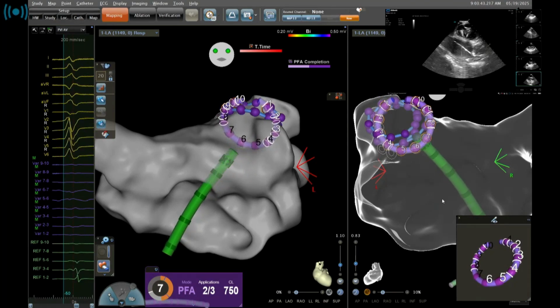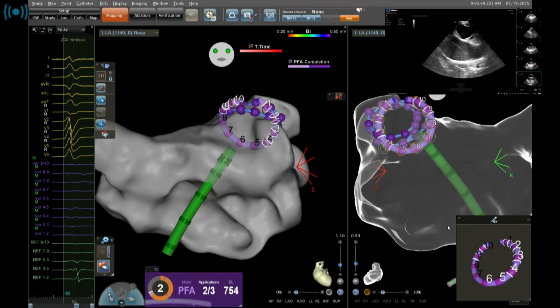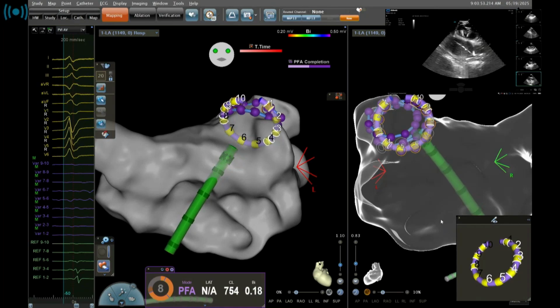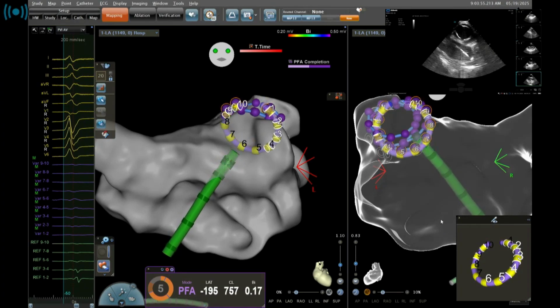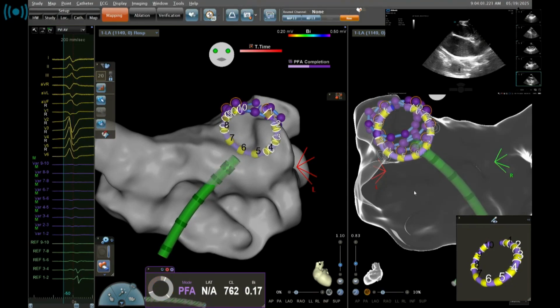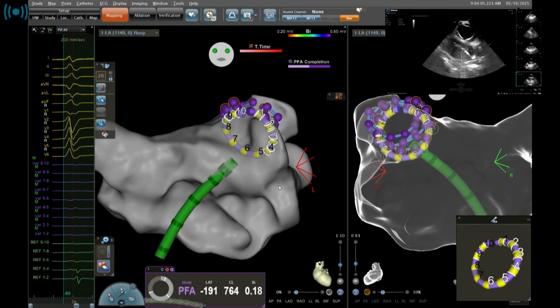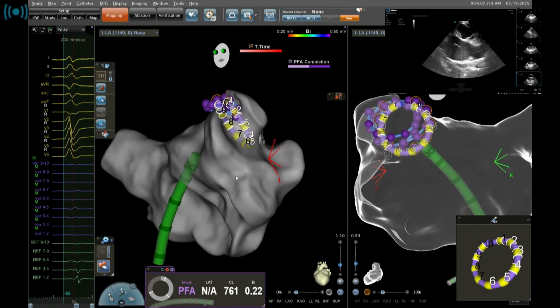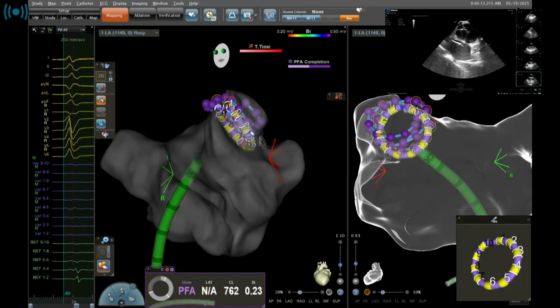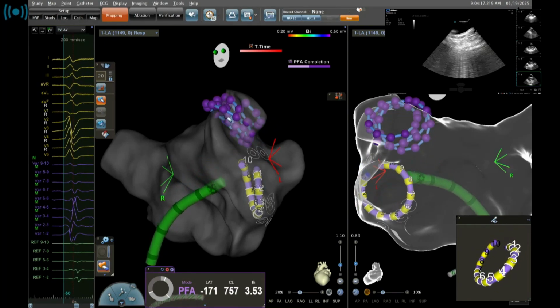Massimo, it's Paul Gould here. With the applications, there appear to be quite a few microbubbles on ICE. Is that typical? Yes, that's typical. And I can tell you that in the first wave of the INSPIRE study, we did magnetic resonance on all patients, and we found no cerebral ischemic silent events. So you're right, there are microbubbles, but we did cerebral magnetic resonance on all our patients in wave 1, and we never found any finding.